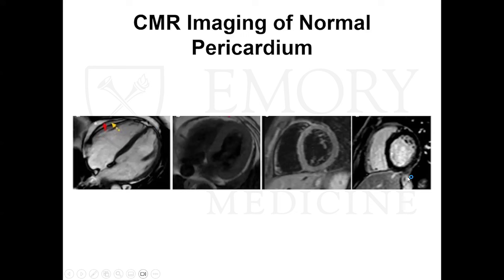You notice, and this is important whenever we go to some of the later slides looking at more diseased pericardium, the pericardium here is not the most noticeable structure on our MR. Certainly there are other structures that are far more prominent. And whenever diseased pericardium comes forward later, we're going to see that more prominently.